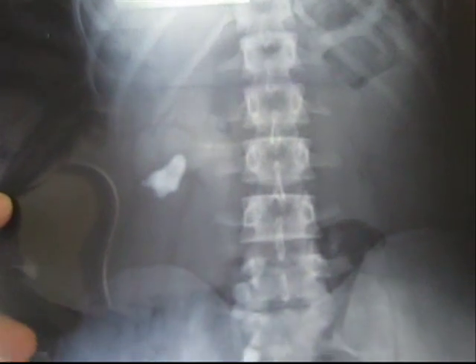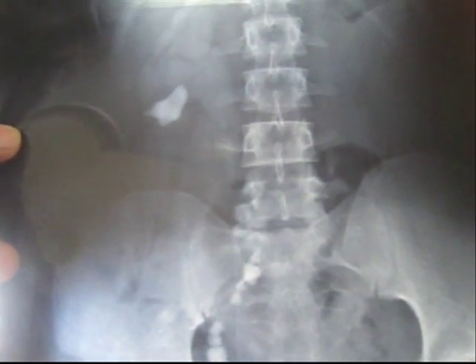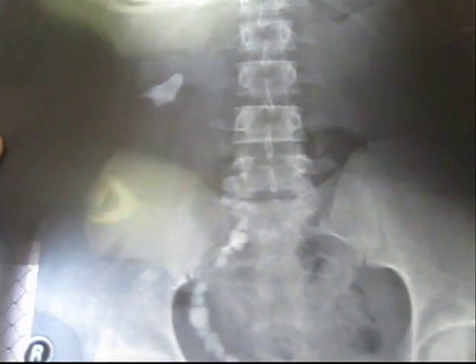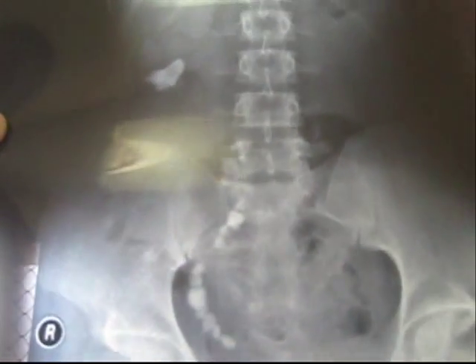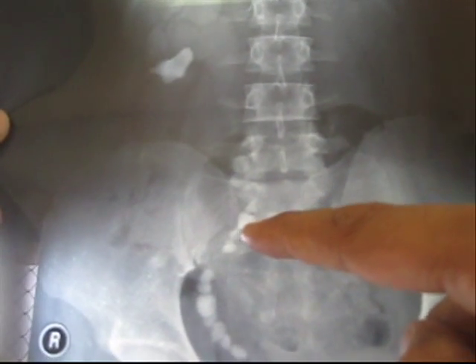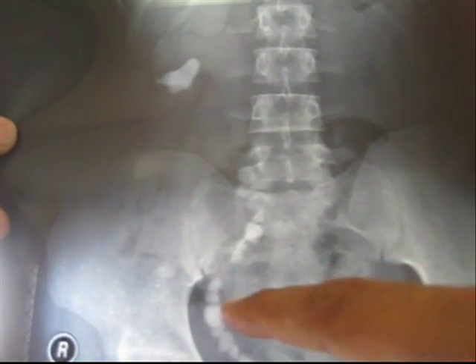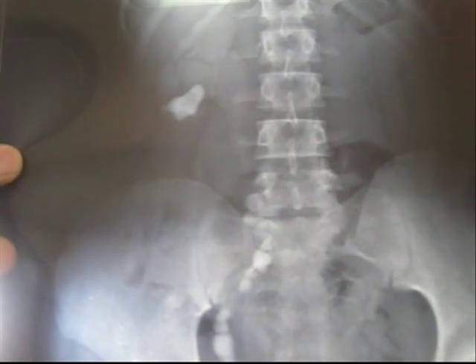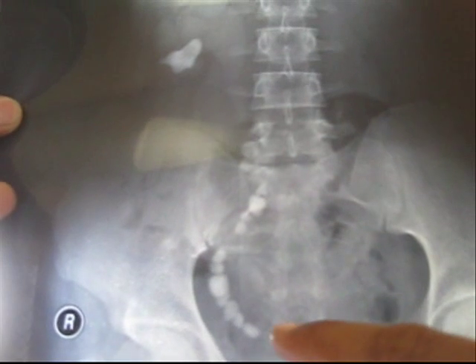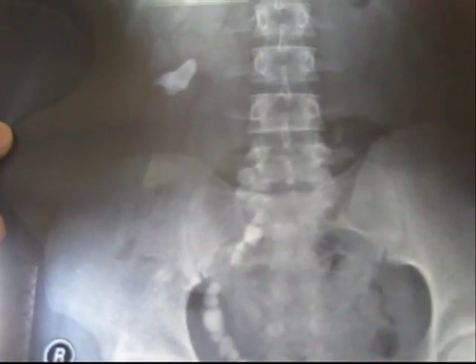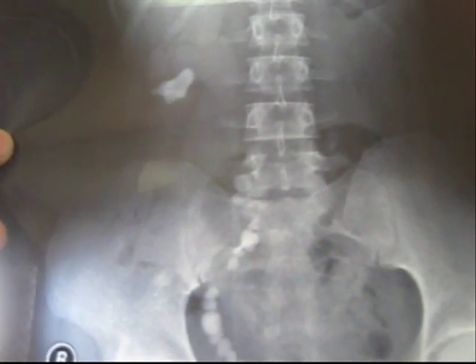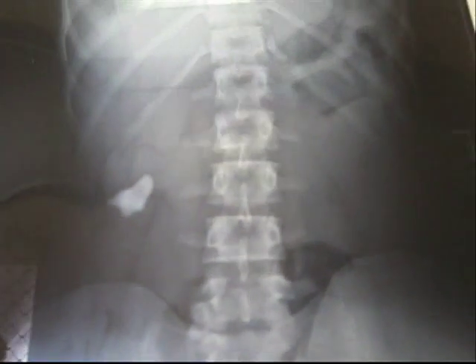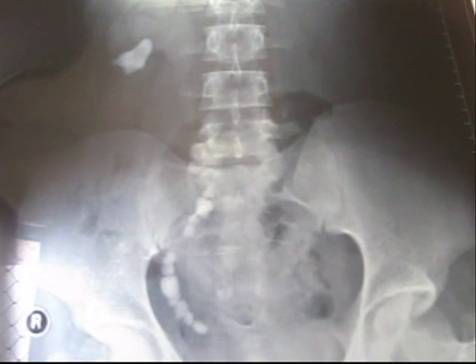Coming to the blue region, you can see at the lower one-third part of the right ureter, there are multiple radio opacities. It may be multiple ureteric calculi — it's a very good finding.